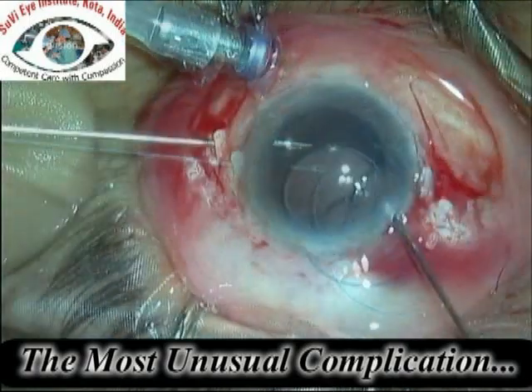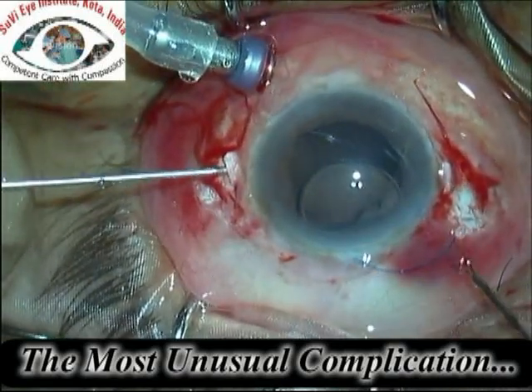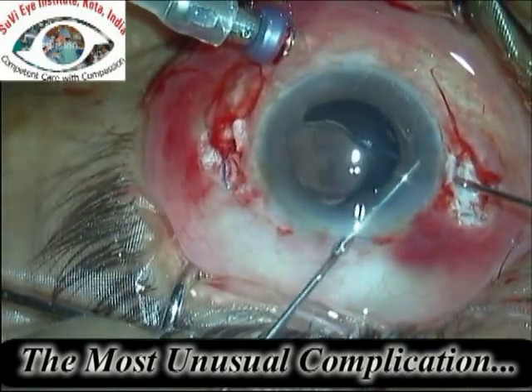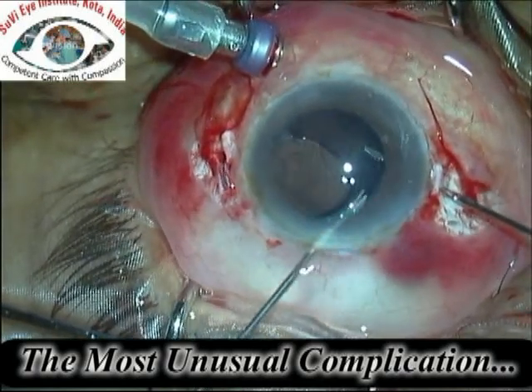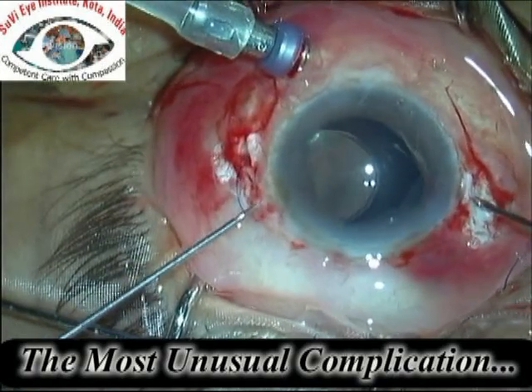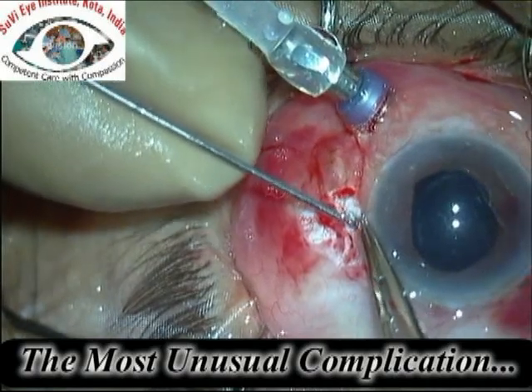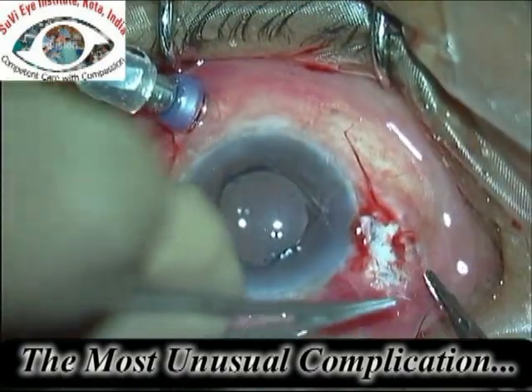This is the Sensar three-piece IOL being injected. The MaxGrip forceps is being used to externalize the haptics using the handshake technique through the tunnel made prior to inserting the IOL. The second haptic is now being externalized in the opposite tunnel using again the handshake technique with the MaxGrip forceps and the tiny scleral flaps over the tunnel are now being sutured.